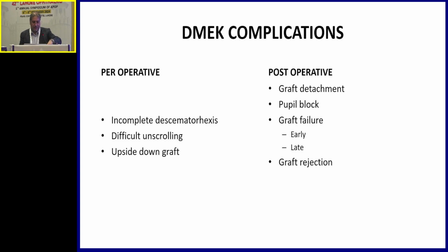Definitely, DMEK has some complications. Incomplete descemetorhexis, we can have difficult unscrolling, upside down graft, which I showed you in the video. And post-operatively, we can have graft detachment. Then again, we have to refill the gas. Sometimes we have to refill the gas more than twice.